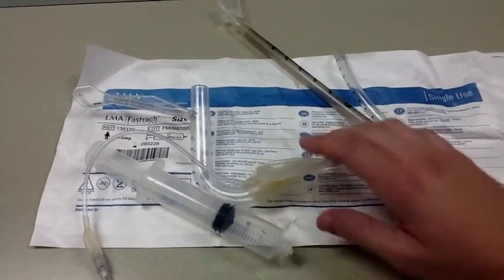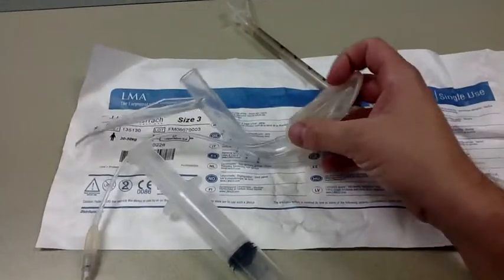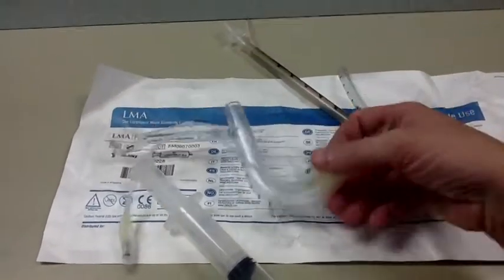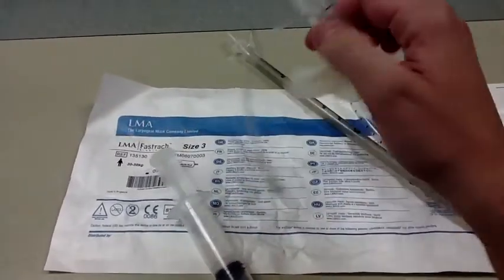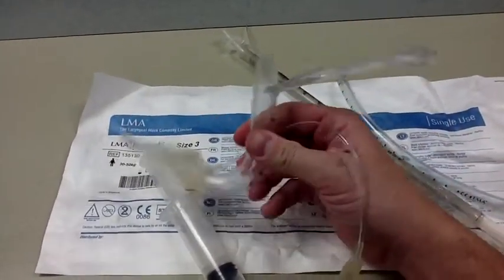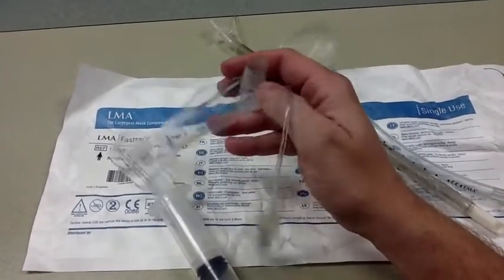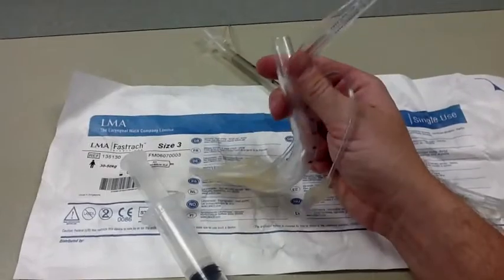This particular one is a disposable device, called the LMA Fast Track, or the Intubating Laryngeal Mask Airway. As you can see, it has a hard plastic construction. The ones you'll see in the operating theater have a metallic construction because they're reusable and you can autoclave them.